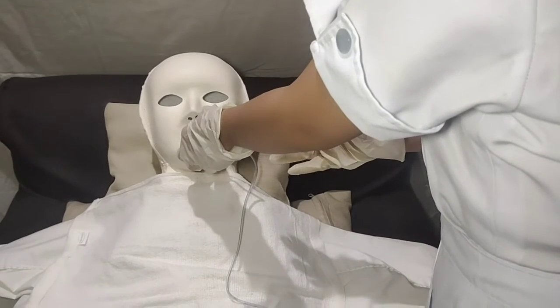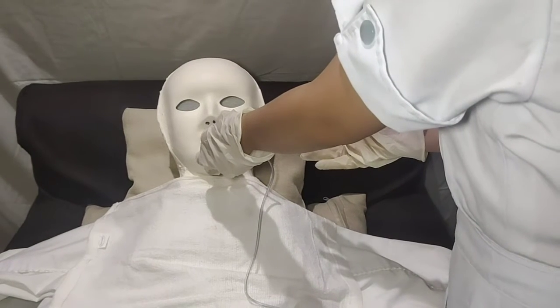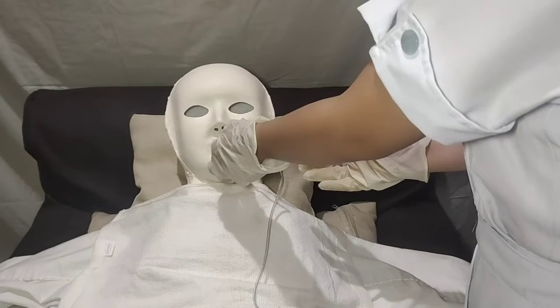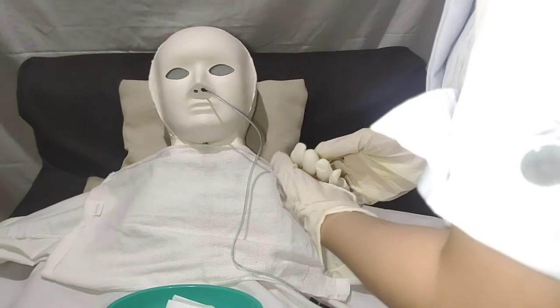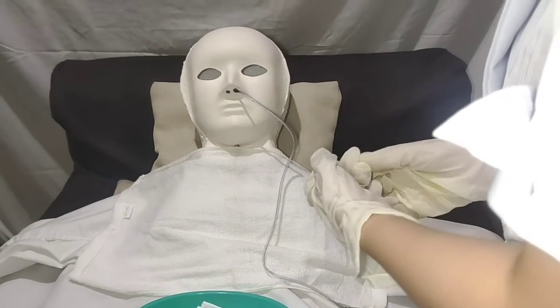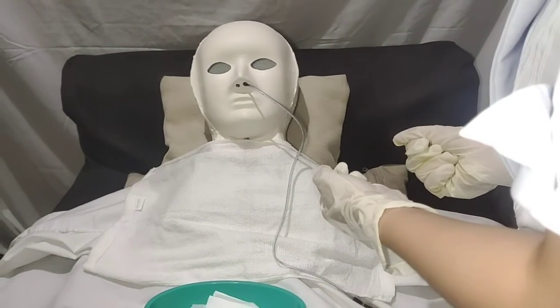Discontinue the procedure and remove tube if there are signs of distress such as gasping, coughing, cyanosis, and inability to speak. After that, secure the tube loosely to the nose or cheek until it is determined that the tube is in the patient's stomach. First, attach syringe to end of tube and aspirate a small amount of stomach contents.